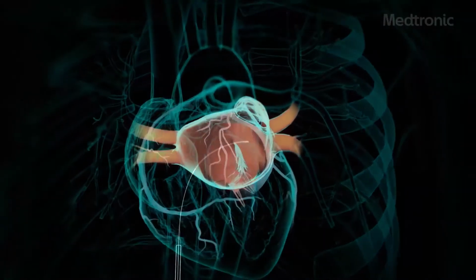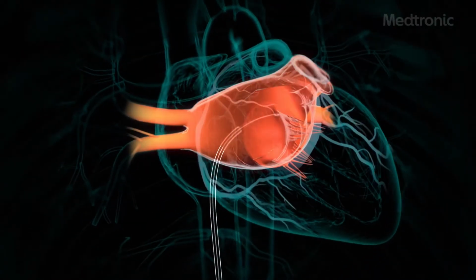It's all done through catheters where we take up through the vessels in the groin, up into the heart, and we ablate that tissue either by heat energy, which is called radio frequency ablation, or we use cold energy, which is called cryoablation. Cryoablation, in my case, is the primary modality we use to do this procedure.